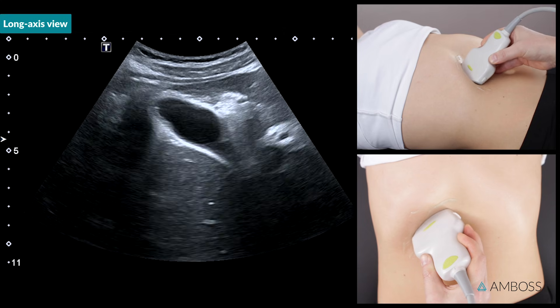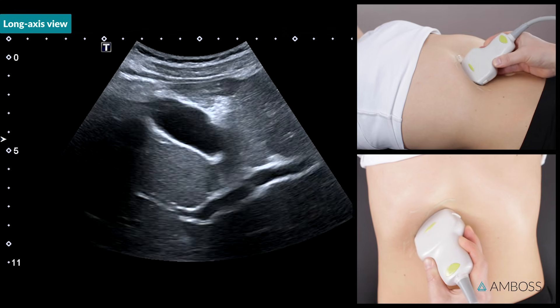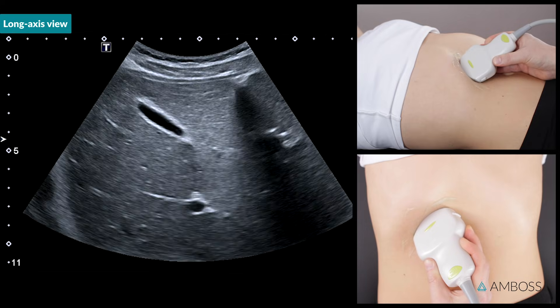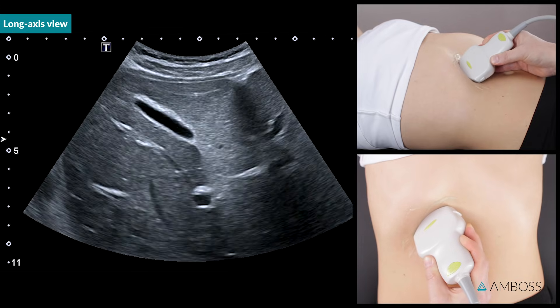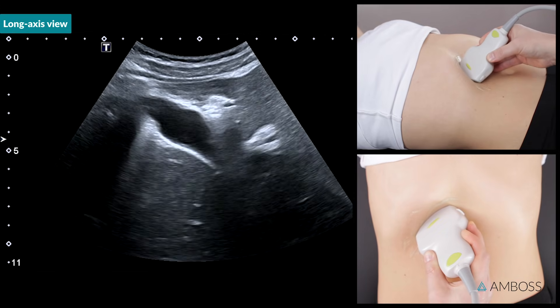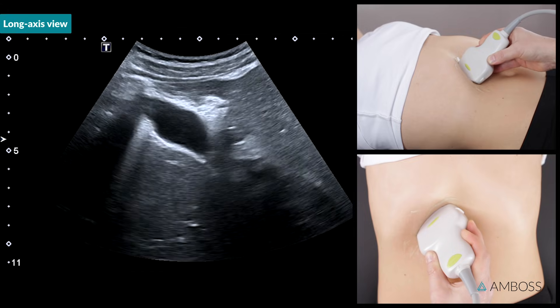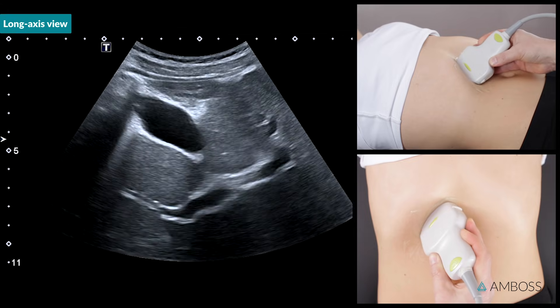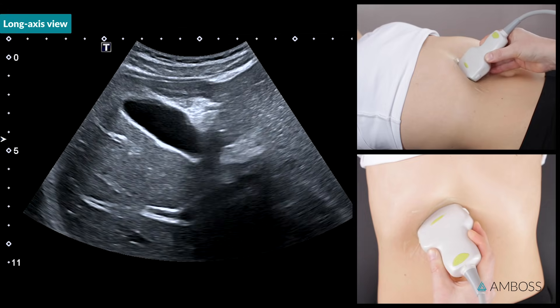Now, fan through the long axis view by slowly tilting the probe, first caudally, then cranially. As you can see, tilting in one direction fans through in the opposite direction.